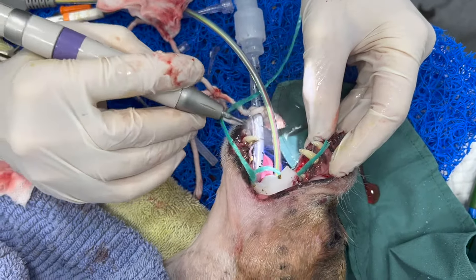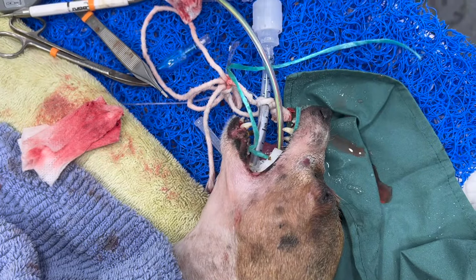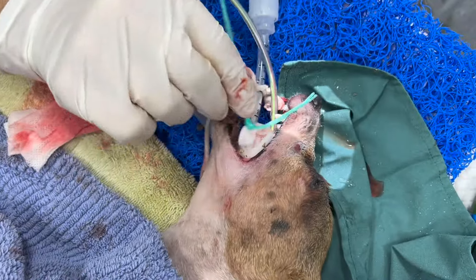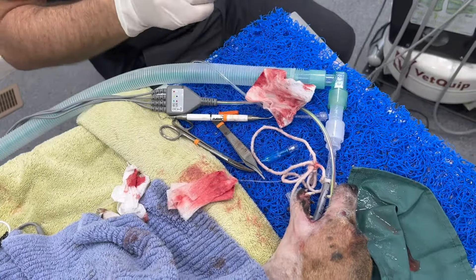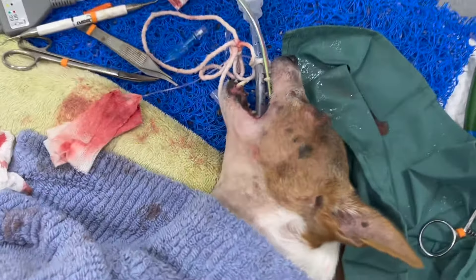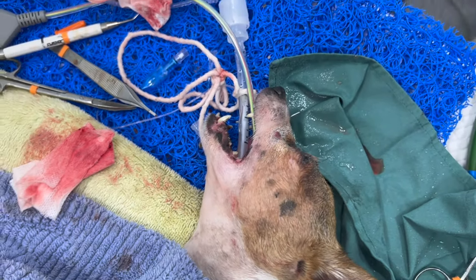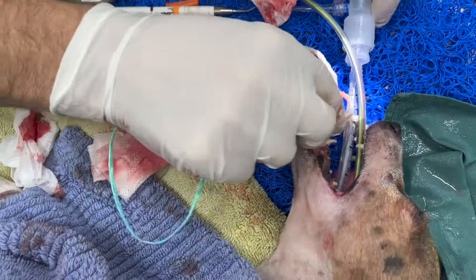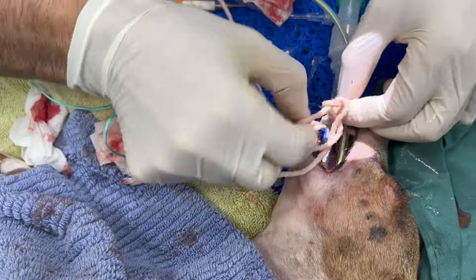For people watching — what's the green string from? The green string is a really cool thing that makes a massive difference. The green string is attached to a swab that I put in the back of the throat. By attaching it to a green string, we can never forget that it's in the back of the throat. It's blocking the throat, and even though there's an endotracheal tube, I want to protect the tube while I'm spraying and working.